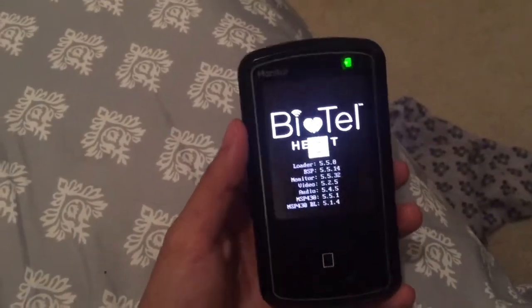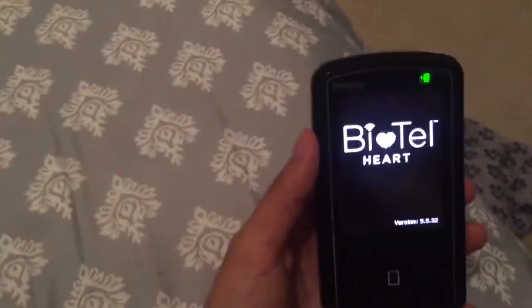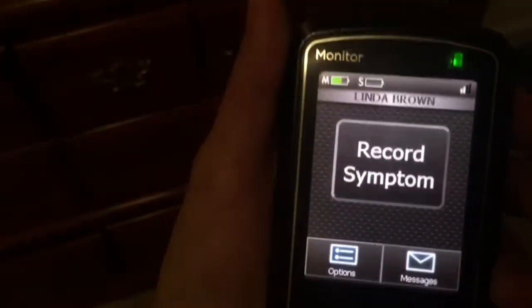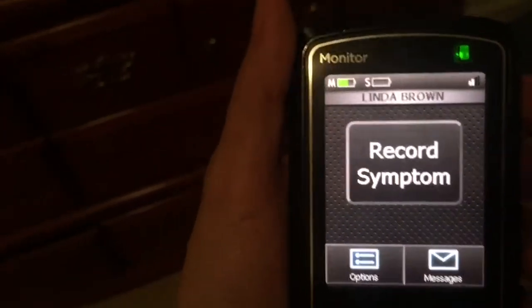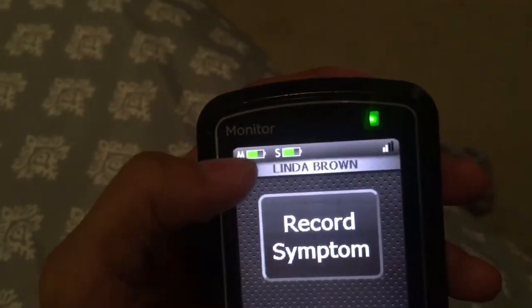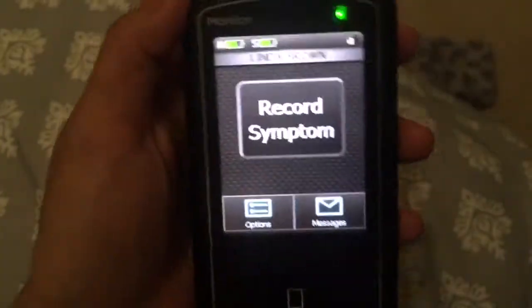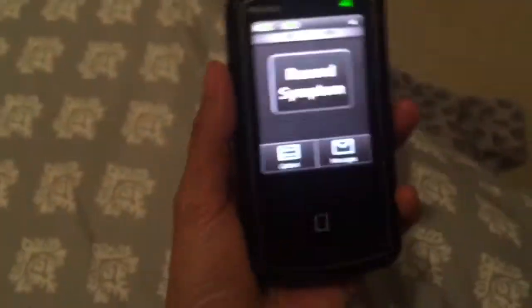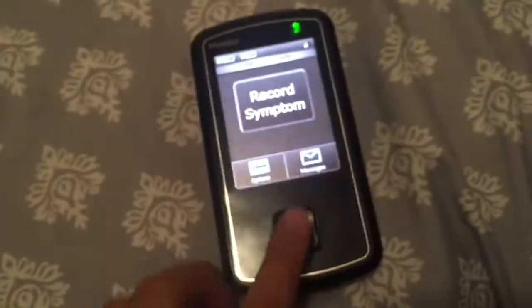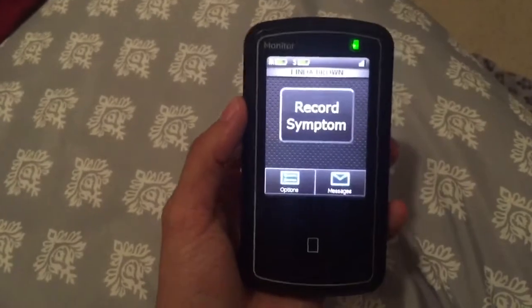It takes a little while to initiate — there we go, it's ready to go. You can see how much battery I have on both monitors — this one and this one. So I'm ready to start getting monitored again.